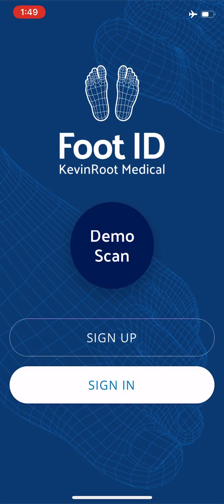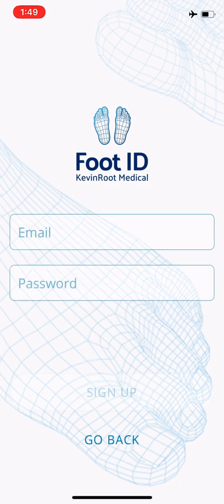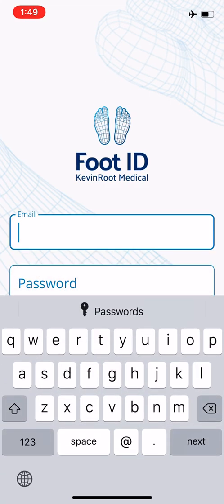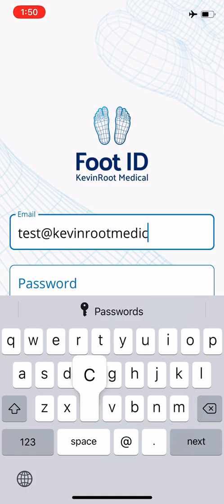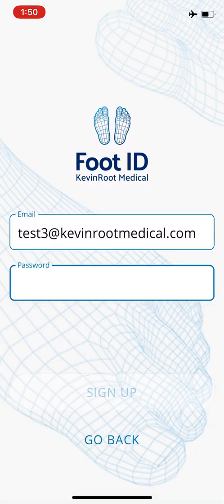I'm going to go ahead and sign up, which you're going to have to do. You can sign up with an email, or with Google or with Apple. I'm just going to do a dummy email — test2 at KevinRootMedical.com. The password needs to be at least six characters. I'll just do 'testtest' and click sign up.